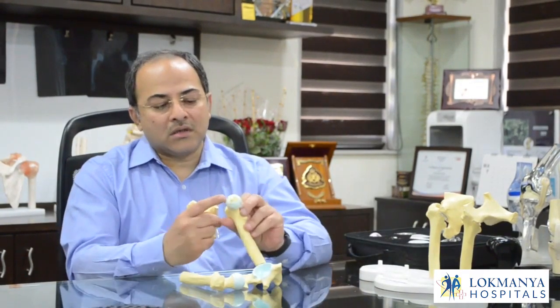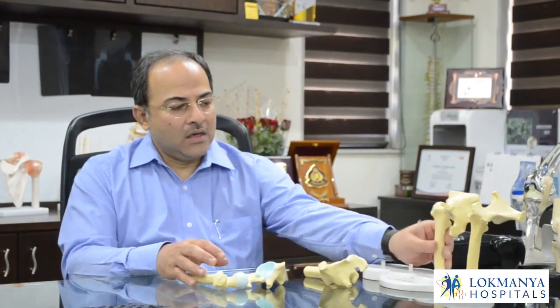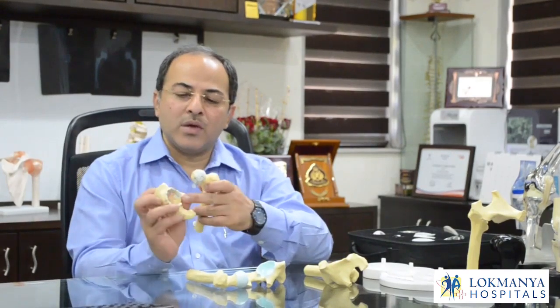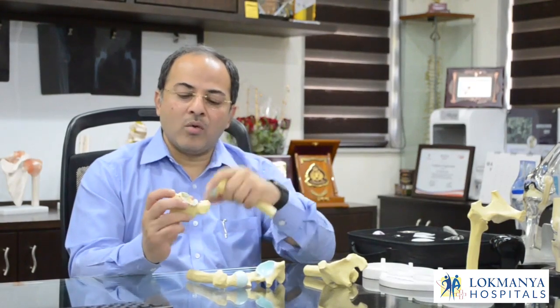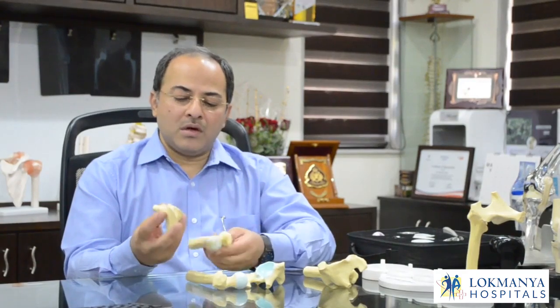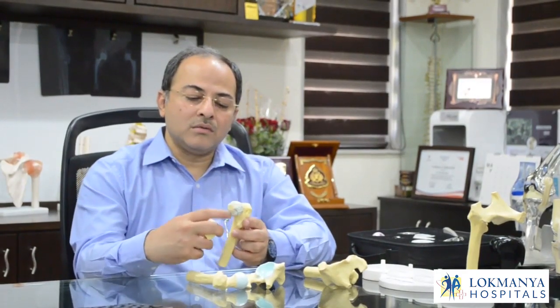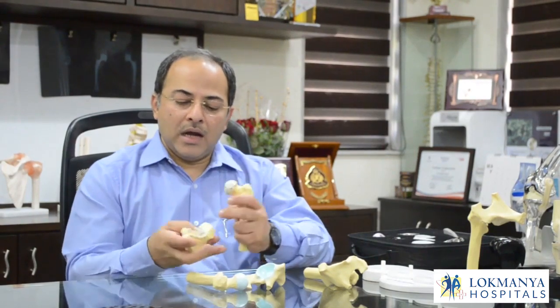Ultimately the socket also gets damaged. In a primary stage it looks partly damaged, and there are four stages of damage. By the fourth stage it is completely and totally damaged — we can see that it's completely fragmented, the shape is no longer smooth or round. At this point we have to do a replacement surgery, removing the damaged bone and replacing it with an artificial component.